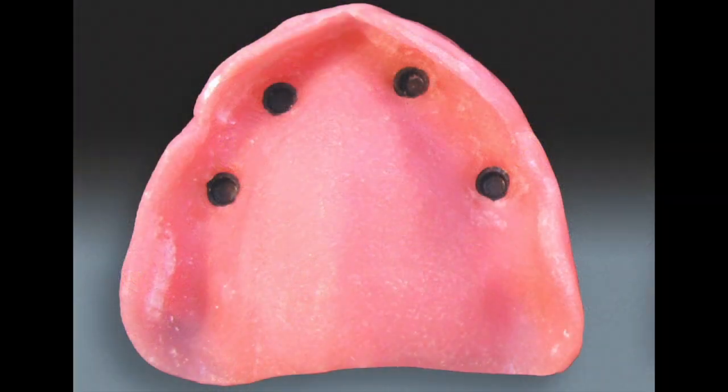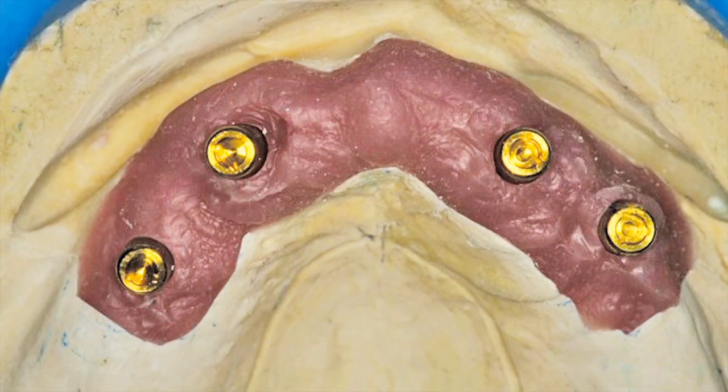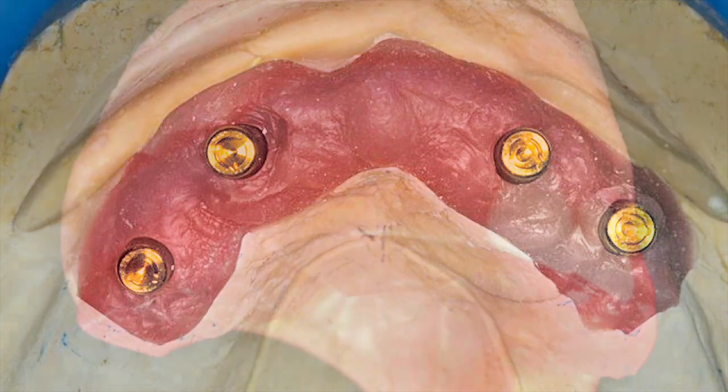The bite block will have the black processing non-retentive caps on the inside — those caps are hollow, unlike the regular retention caps which have an island in the middle for retention on the center and outside. Remove the healing abutments from the patient's mouth, and on the master model you'll see the locator abutments to be screwed onto the implants — place them on the same implant as they are on the master model. There are differing heights to these locator abutments depending on how deep the implant was placed; we want all four as parallel and as level as possible.